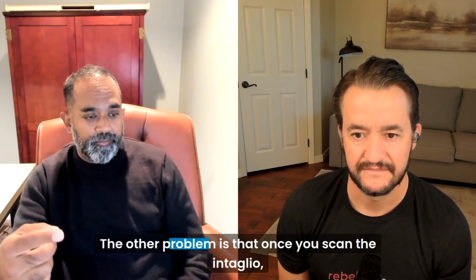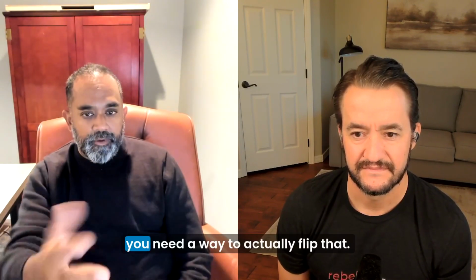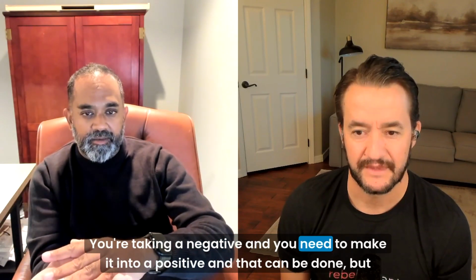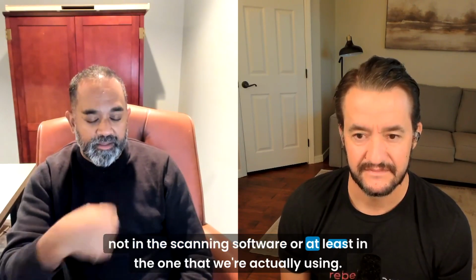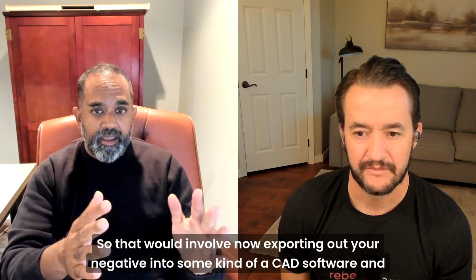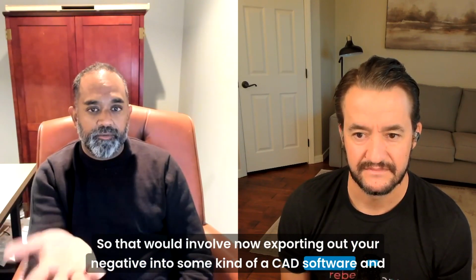The other problem is that once you scan the intaglio, you need a way to actually flip that. You're taking a negative and you need to make it into a positive, and that can be done, but not in the scanning software, or at least in the one that we're actually using. So that would involve now exporting out your negative into some kind of a CAD software and flipping the normals.